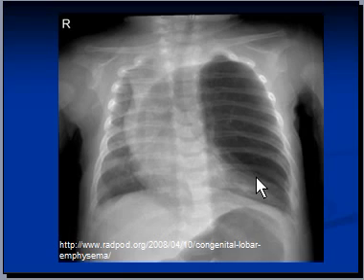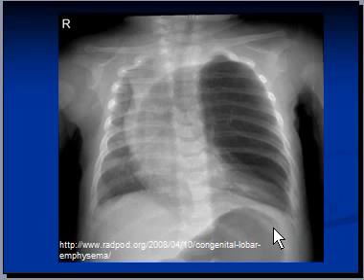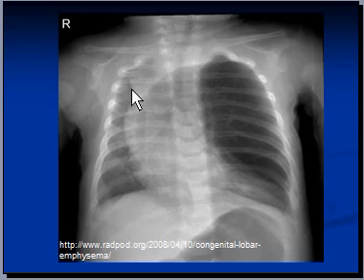The word 'congenital' means by birth, and 'emphysema' refers to hyperinflation of the alveoli. In this particular example, the left upper lobe is hyperinflated — in fact, ballooned. Notice the straight and flat hemidiaphragm and a triangular opacity: this is the partially collapsed left lower lobe. The darkness of the left lung is due to air trapping in the left upper lobe, and the partial collapse of the left lower lobe is due to compression caused by over-distension of the left upper lobe.